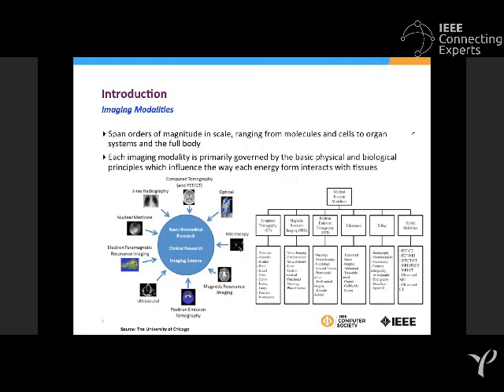When you use a CT, both the detector and the source move around the body in a 360-degree form, so you can get very holistic information, and you can get three-dimensional information of the body. So once you move from the X-ray to the CT, your modality by itself gives you three-dimensional information compared to 2D information when you go to the X-ray.